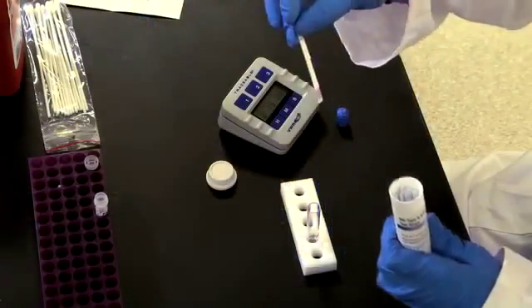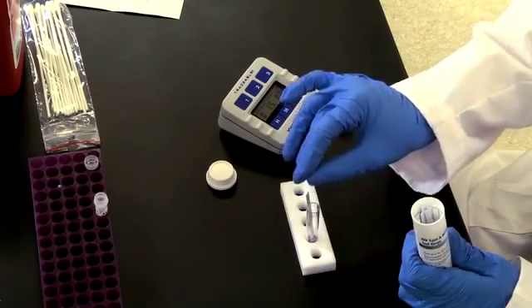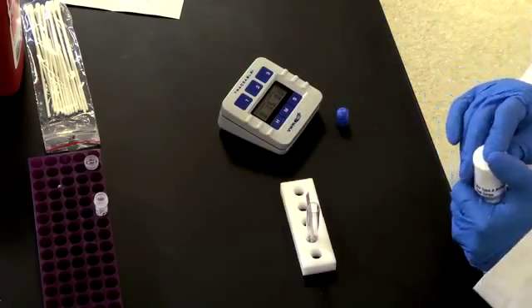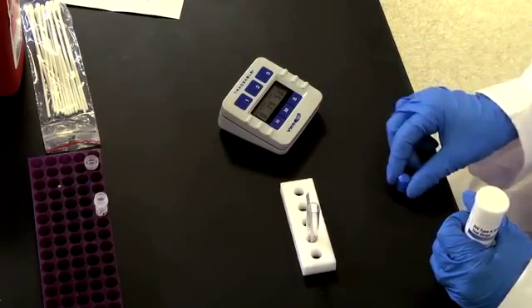Place the test strips directly into the test tube containing the sample. Position the test strip so that the pink pad is submerged in the extracted sample. Allow the strip to incubate in the sample for 15 minutes. Remove the test strip from the test tube to read the results.